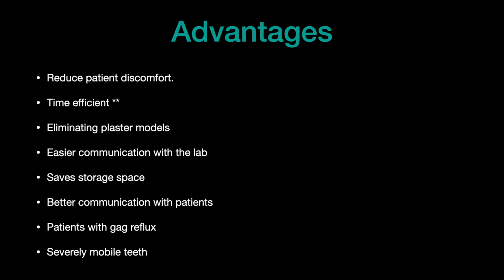They will also eliminate plaster models, which is a huge advantage, because then we won't need the storage space to store these plaster models. You will have easier communication with the lab, and also easier communication with patients. You can show them how you anticipate the treatment will go. You can show them a post-op idea or a diagnostic wax-up on a digital wax-up, and it's helpful in severely mobile teeth.